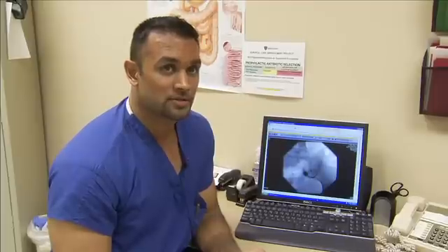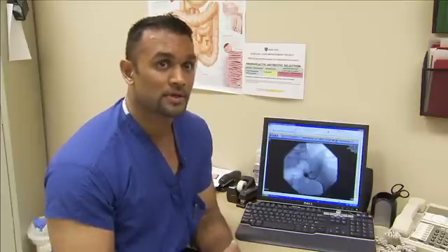It's really important to understand that when performing a diagnostic SI joint injection, you're not always going to get contrast that flows through both the posterior and anterior SI joint spaces. But it's very important that you at least see medication or contrast flowing into the posterior SI joint space.